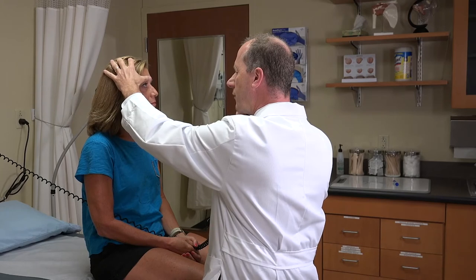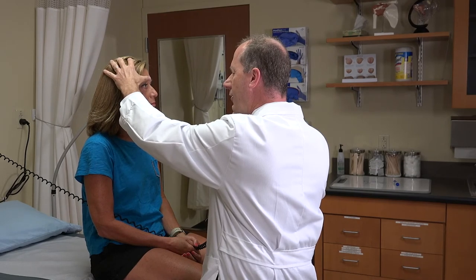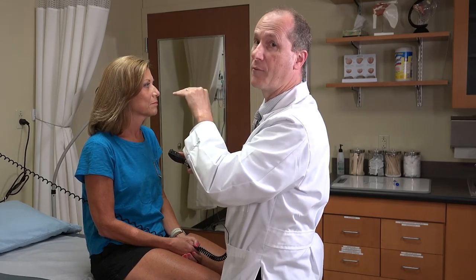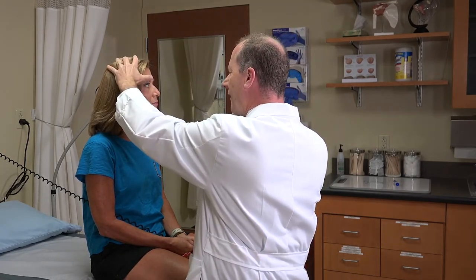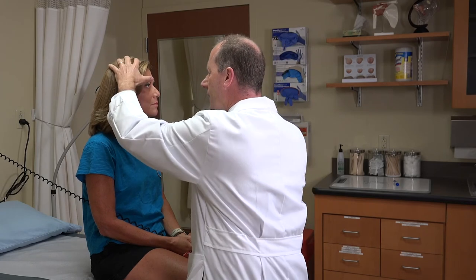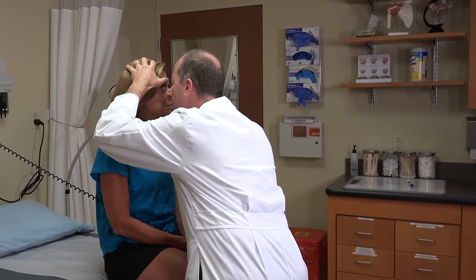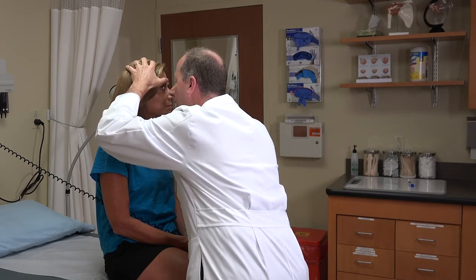I go about 20 degrees out. Just look down a little bit for me — just right over my shoulder. Now, from right here, believe it or not, I can actually already see her disc. Because remember, the zero and the red numbers are an infinite lens, so the focal point — once it's in focus — doesn't matter if you're five feet away, five inches away, or five millimeters away, it's going to maintain that focus. I look right here and say, am I in focus or not? I may move it just one — that moves it a little bit out of focus. And once I have it, I move straight in and land right on the disc, and can move just a little bit to see everything I need to see.